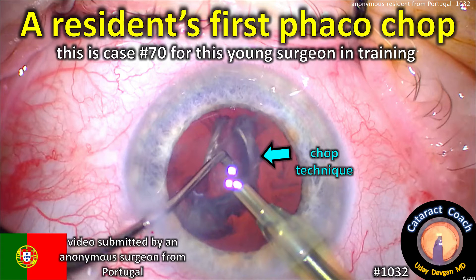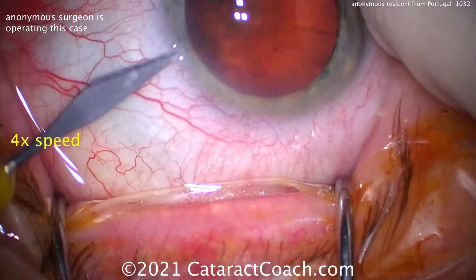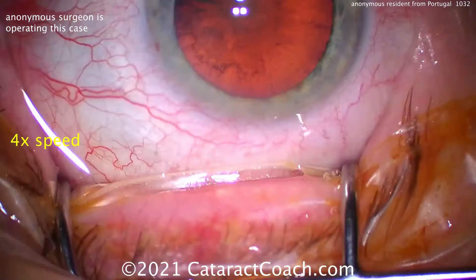cataractcoach.com — a resident's first FACO chop. We have an anonymous video from a surgeon in Portugal who is doing his training, and this is surgery number 70. So 70 cataracts in, let's see where we are.